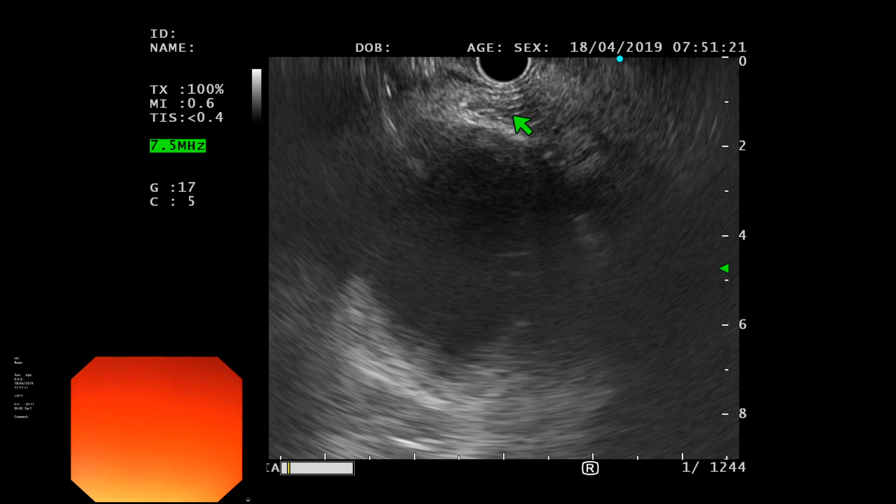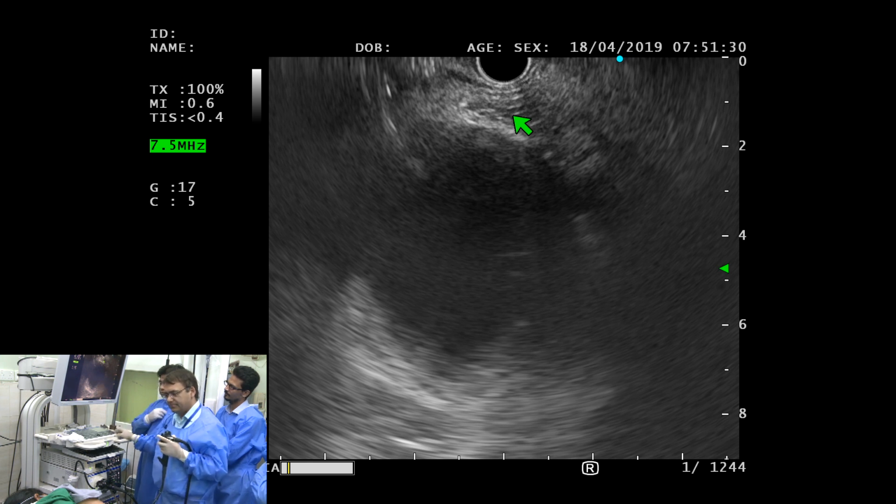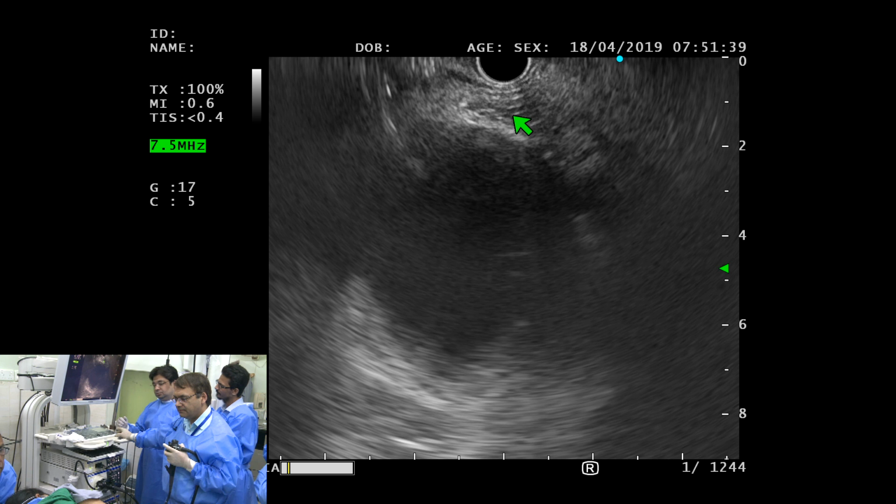As you go in, if you want to look at the mucosal layer, you go in and see with a larger image so that you can see all the layers. Or if you want to see a small lesion, how it is arising, you will be able to see that with a magnified image. So you are magnifying when you're going in, and you're making it smaller as you're coming up.